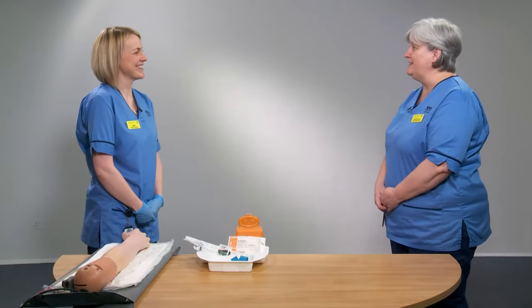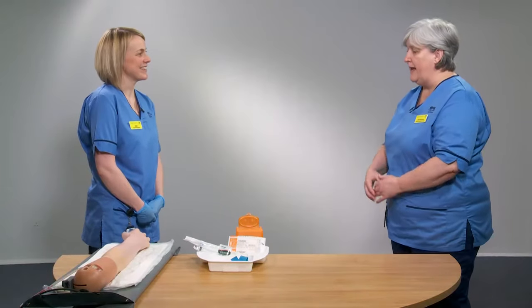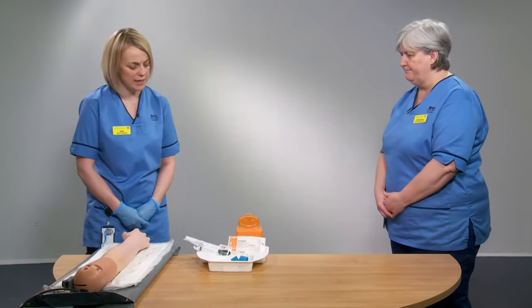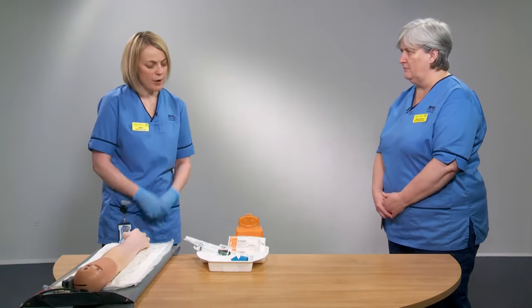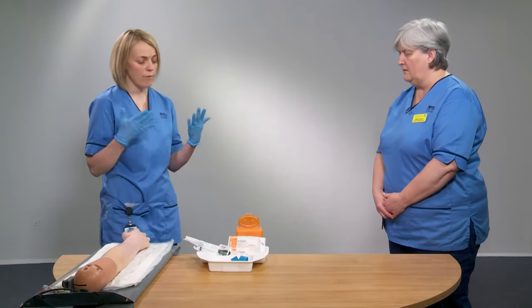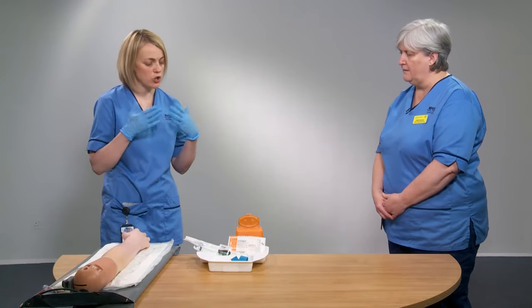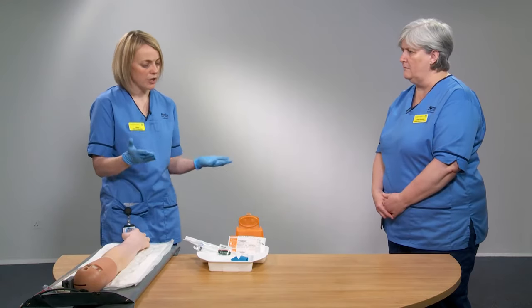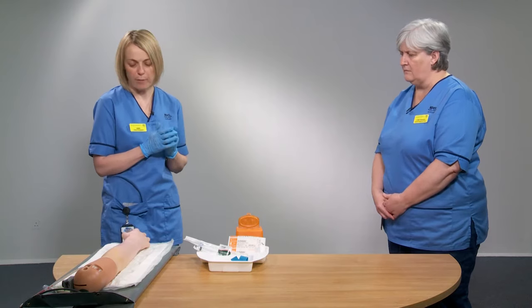Thanks for agreeing to demonstrate the cannula insertion. Can you talk us through what we would do? Absolutely. The first thing we need to think about is our PPE. When undertaking cannulation, you should always do your appropriate hand hygiene, don your white apron, and your blue nitrile gloves.